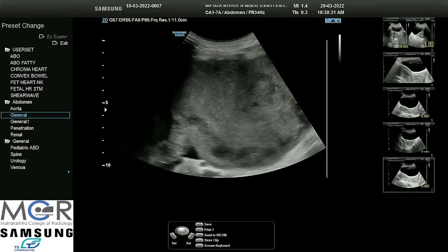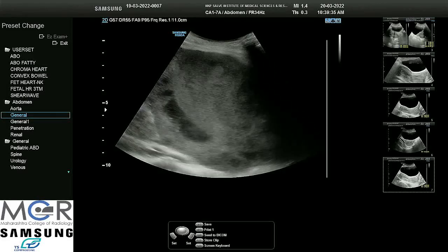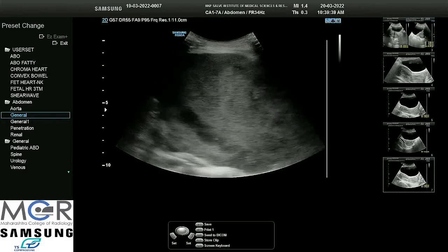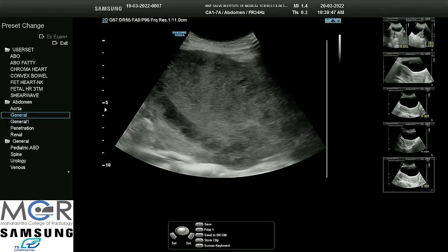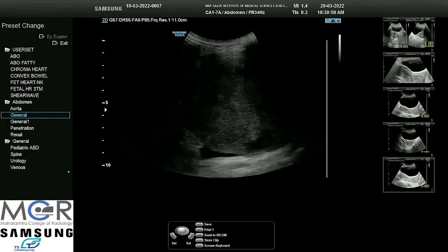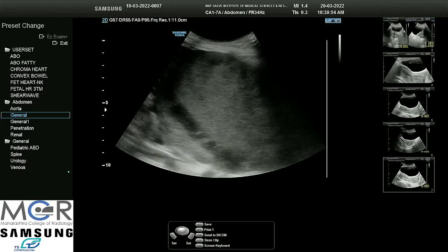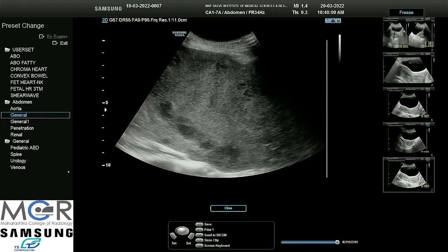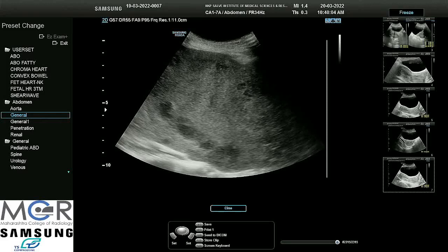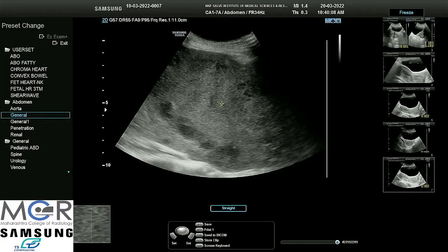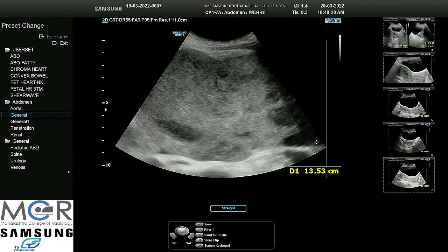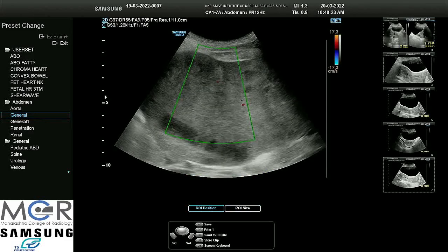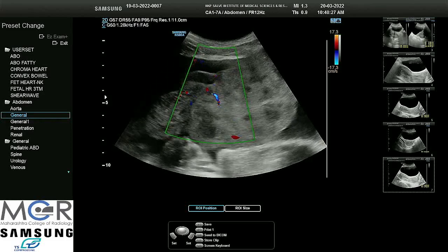I try to fit this into IOTA easy descriptors, but none of the benign easy descriptors can be applied. The malignant descriptor for postmenopausal patients obviously cannot be applied either. So I move to the simple rules and apply benign and malignant descriptors. I find the lesion is solid and measuring around 13 to 14 centimeters — more than 10 centimeters.